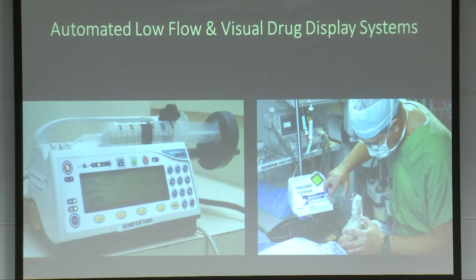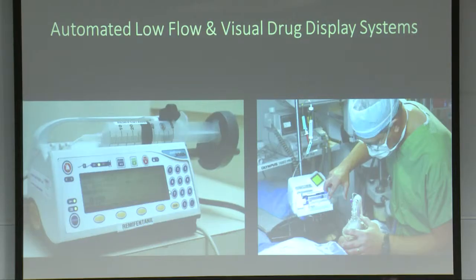I'd like to now move to the intravenous drugs and the work that's done there to show the kinetics and dynamics of these drugs. To capture the amount of drug delivered, we can use a computer interface to the infusion pump to capture that rate of delivery. With the drugs that are given in a bolus via syringe, DocuSys is one example of a camera behind the syringe that measures the barcode on the syringe to tell you which drug it is, measures the volume delivered, so you capture that information.